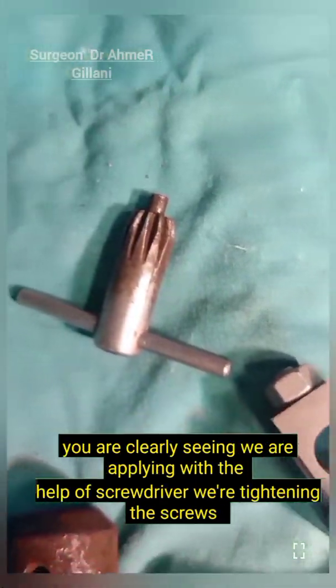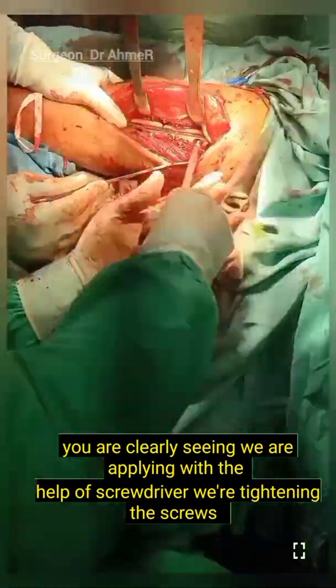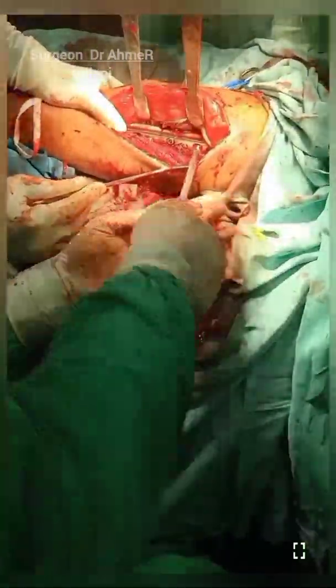In action, you can clearly see that we are applying the screwdriver to tighten the screws.